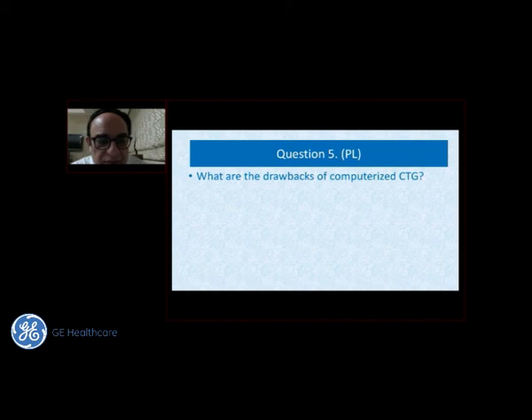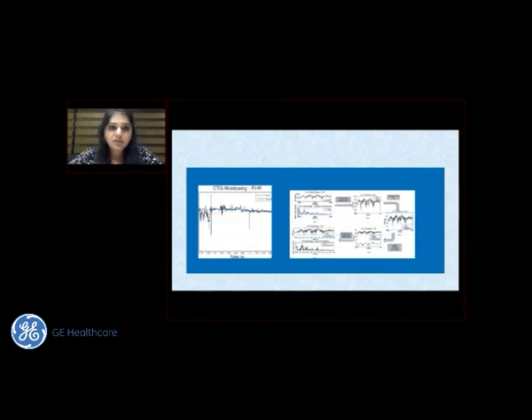But even for a normal CTG, the answer lies in the sequence of changes that happen in fetal growth restriction, which has been beautifully provided by Professor Ahmed Baschat. So he's clearly mentioned in a lot of studies that the Doppler changes precede any changes on the CTG or biophysical profile.